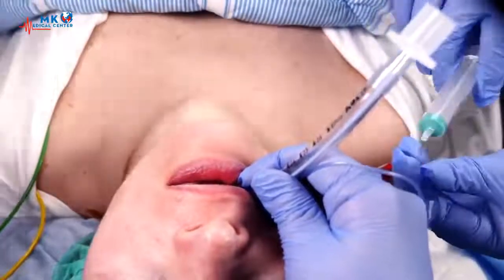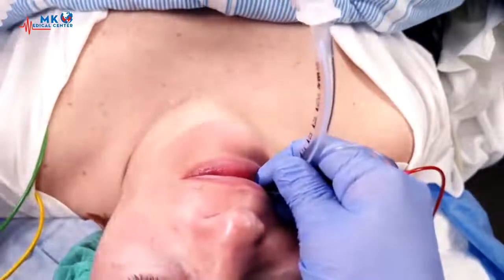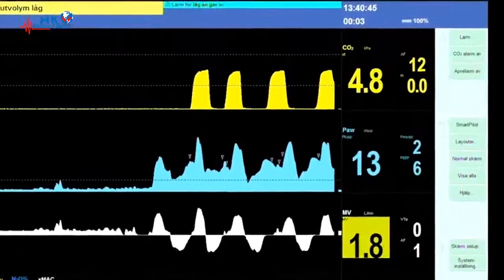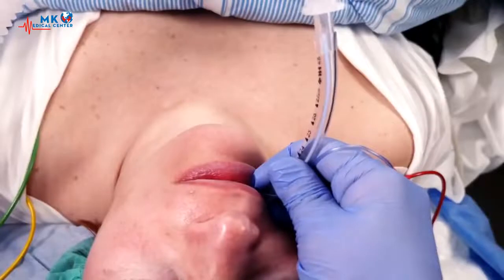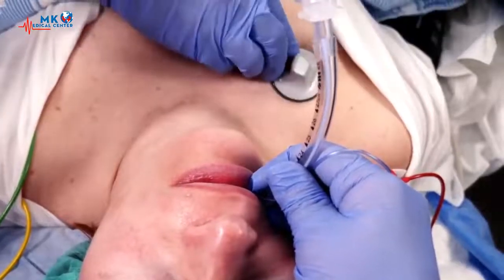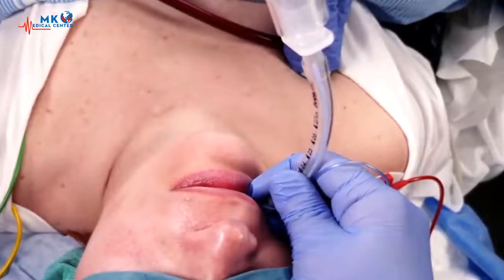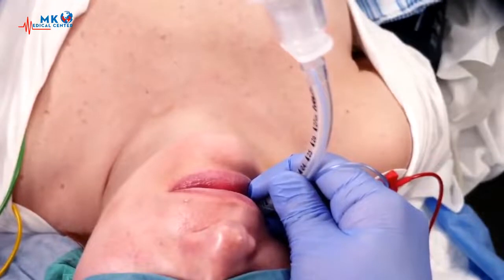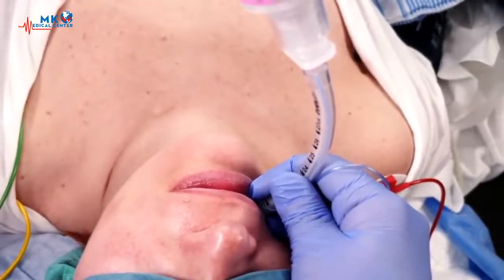Hold the tube firmly while you confirm that it's lodged in the trachea and not the esophagus. The gold standard is return of end-tidal carbon dioxide over several respiratory cycles. Be very cautious when interpreting the other signs traditionally used: auscultation of both lungs, condensation in the tube, and the symmetric rise of the chest wall, as these may very well be positive despite an esophageal intubation.